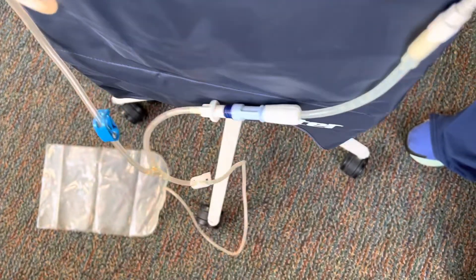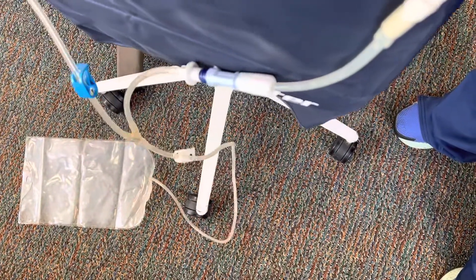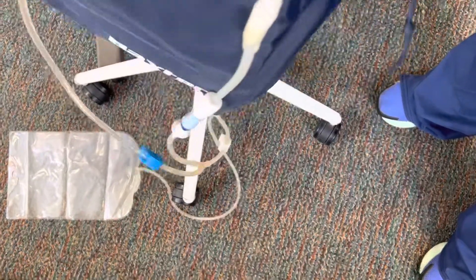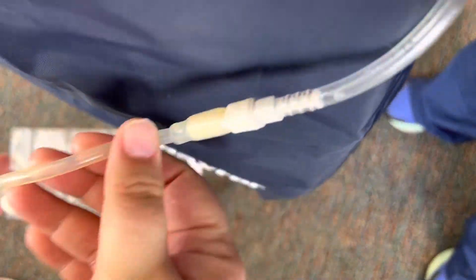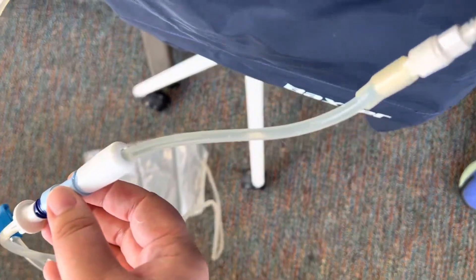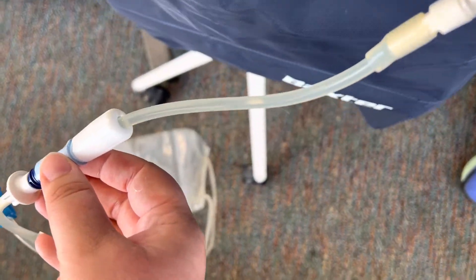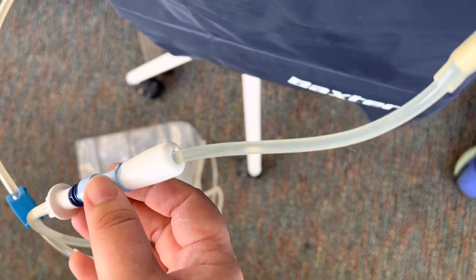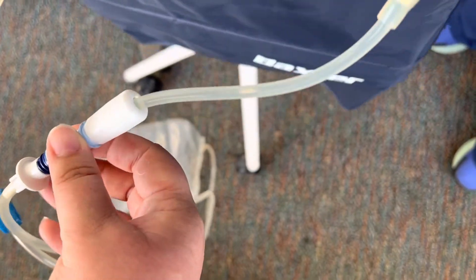Now while you're watching this, you do want to make note that the patient is handling it okay. You want to look at the output and make sure that it is clear. You should not have any bloody solution in here, and you want to make sure you're not seeing any sediment, any leaks, or anything like that.